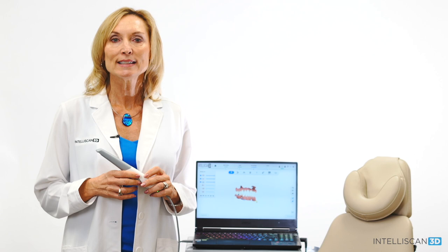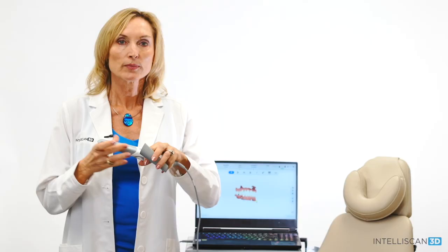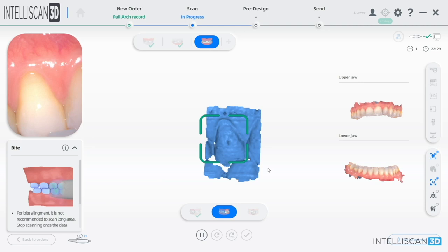For an easier acquisition of the posterior teeth and to ensure more comfort to the patient, we can now switch to the smaller scanning tip. Switching tips is easy and fast — just unplug the tip and connect the new one. The LED around the tip will turn green as soon as the connection is completed. Once both arches are completed, the alignment between the two arches is going to be incredibly fast.